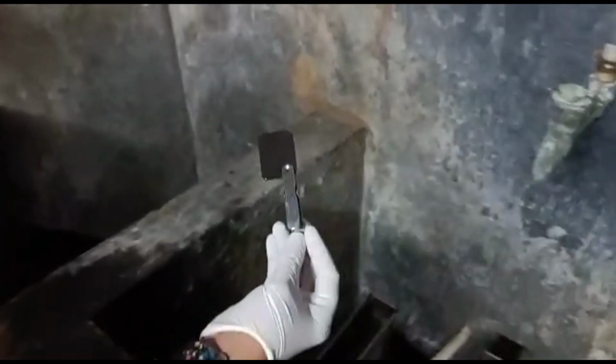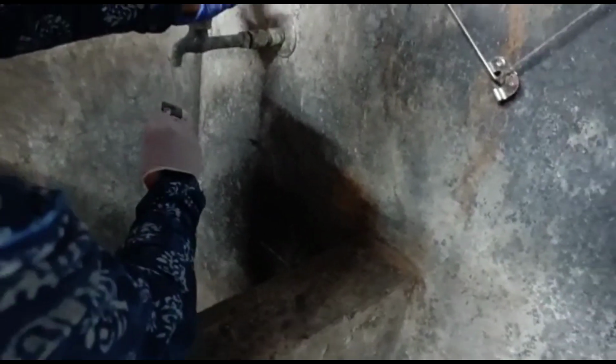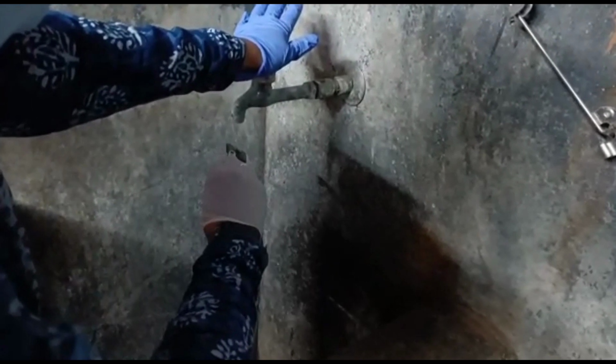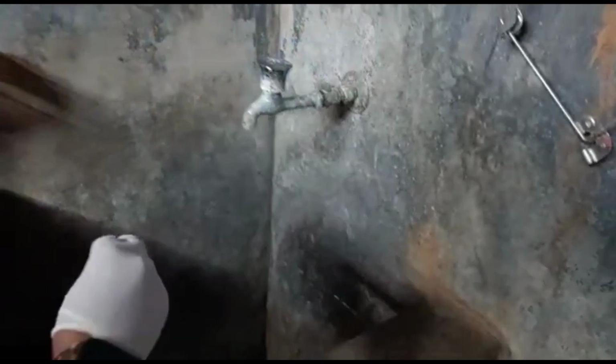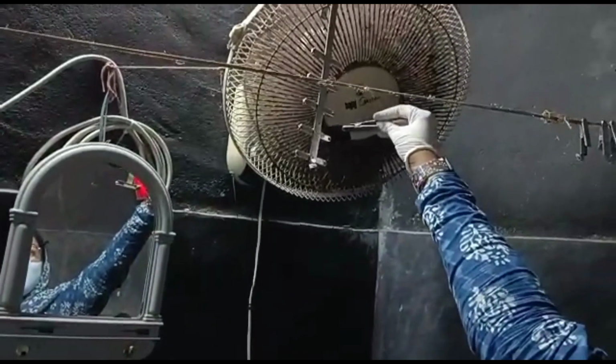Once you place the film in the fixer solution, you can switch on the light and see the image that has been taken, and then you can pass the X-ray film under running water so that you remove all the solutions that have precipitated within the film, and then you can keep it for drying. You have a drying machine also.